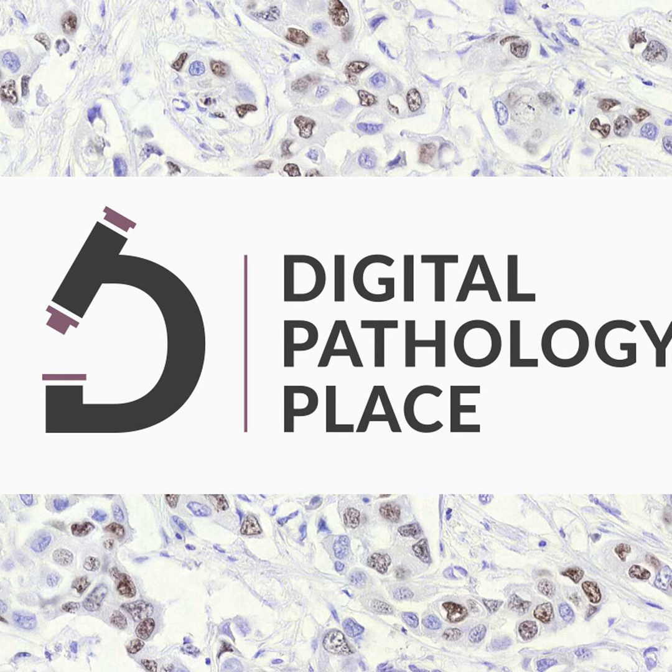Yes, so here, the whole slide image files referred to here as the original whole slide image files should be retained. So the originals, we retain the originals. But any technical image processing modifications made to whole slide image files prior to being provided to pathologists should be documented and retained. This is not really happening, and you should get the original. As a pathologist, you should get the original, and so then you don't have to document anything. If there is some smoothing, color manipulation happening before you get the slides, then of course you have to document it and retain this information.